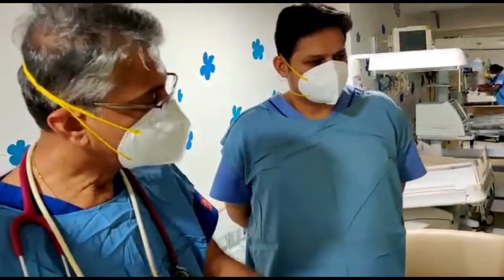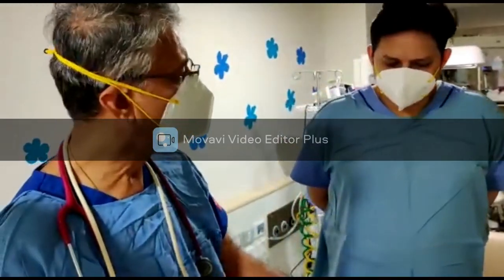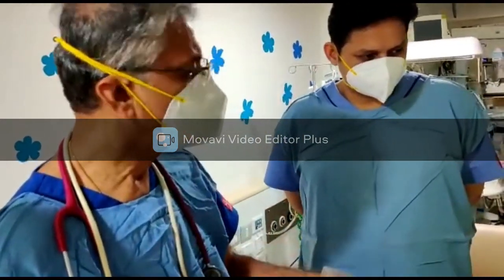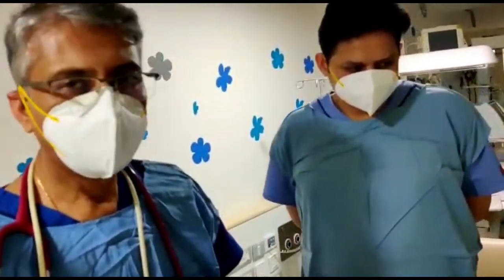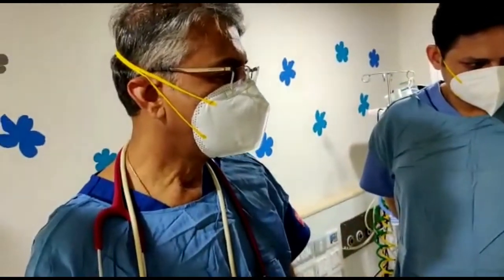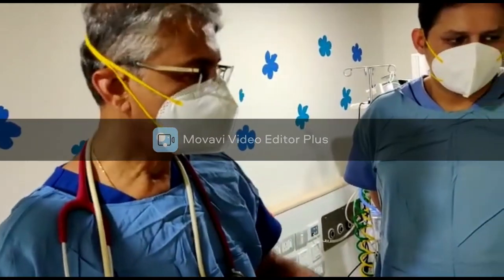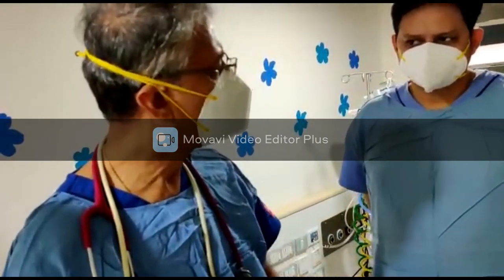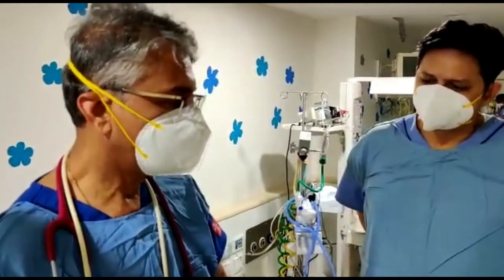So in a nutshell, there are so many parameters to assess left ventricular function, but these are the basics. Anybody can do this. The clinician who is taking care of the baby, with some knowledge of echocardiography and consistency, can perform these things, especially when the cardiologist is not available. And it is a dynamic process. You should keep on doing this in a baby who is sick to know whether the baby is improving or not, especially when the baby is on inotropes, whether it is improving on inotropes or not.